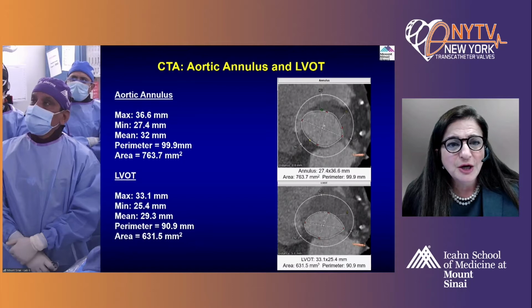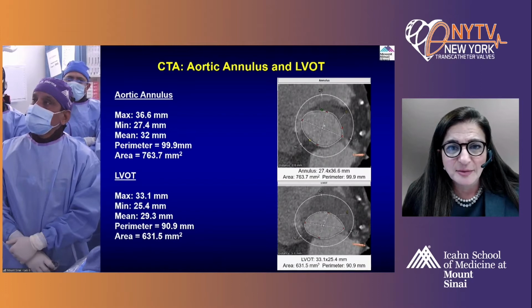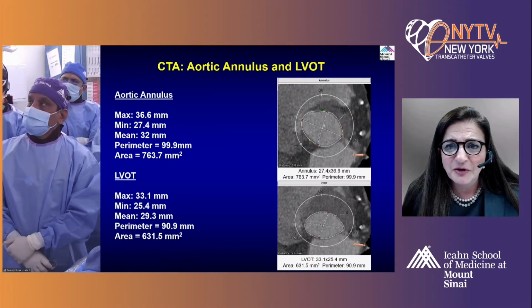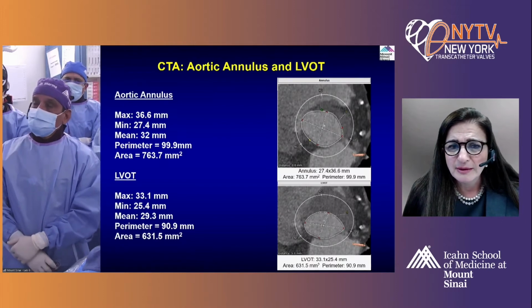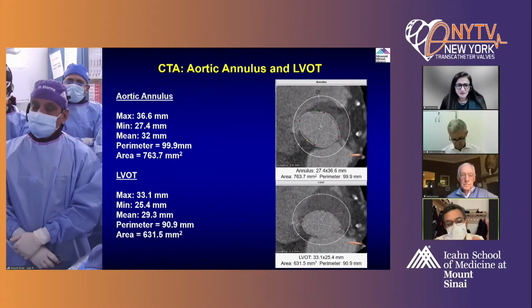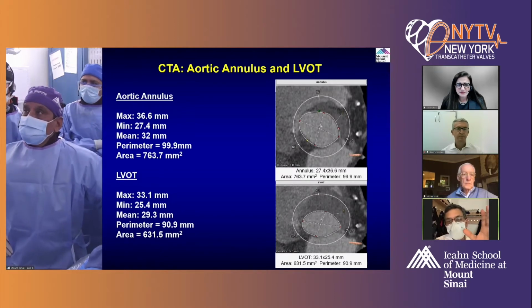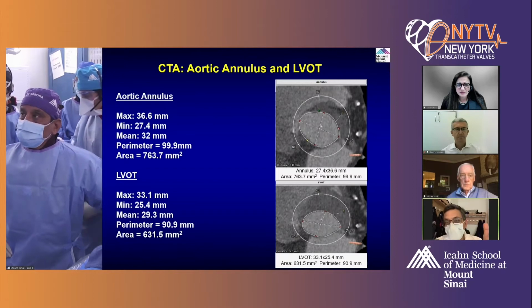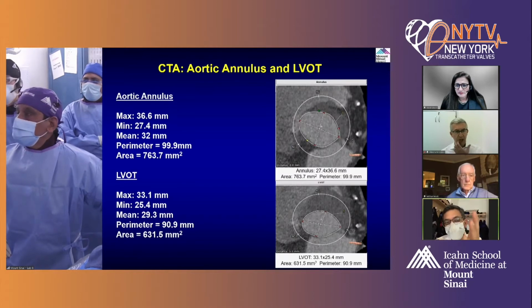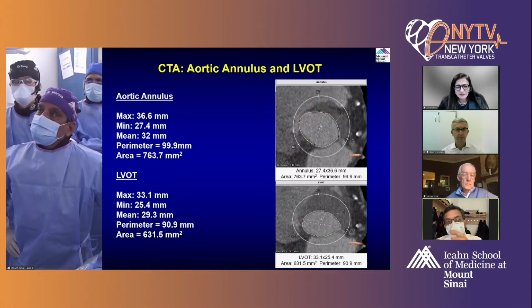You showed us a change in the hemodynamics, and I wanted to see if the panelists had some thoughts about that because I think this is a really big teaching point. Samir, Mike Mack. Samir first, then Mike. I think that in the bicuspid aortic valve, many times, because of the eccentric jets, transthoracic wise, sometimes you cannot align to the jets properly. So either invasive or a more detailed analysis is necessary when we think that the valve is calcified and not opening and the gradients are low.